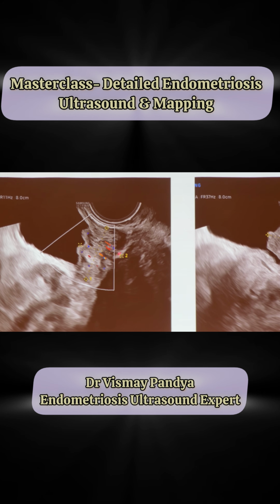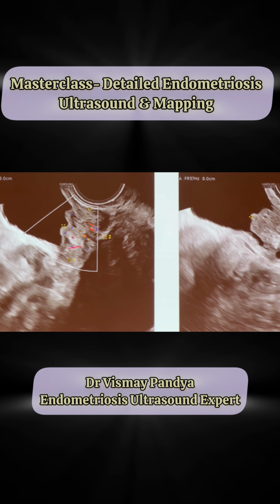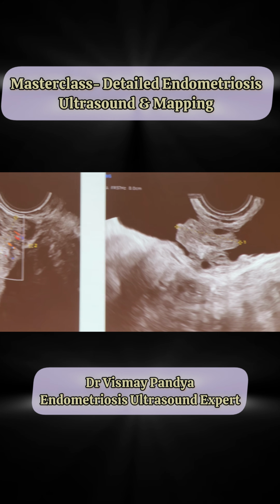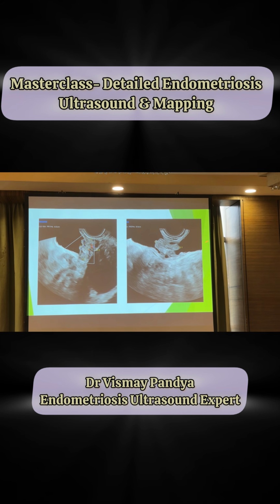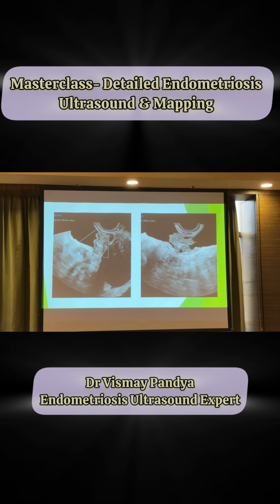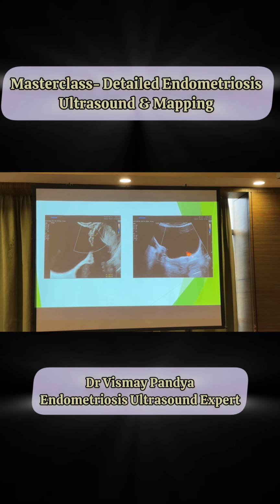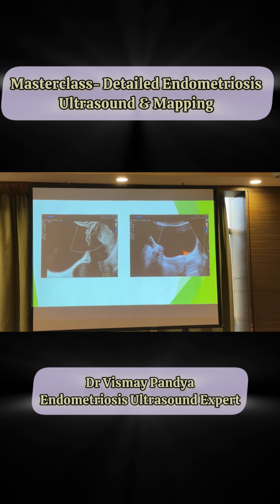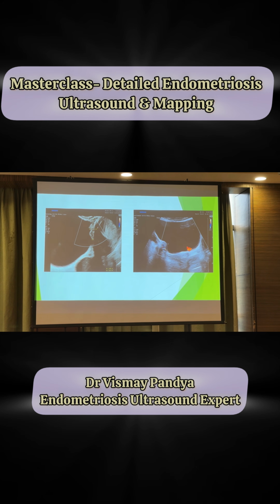So this is the bladder endometriosis. You can see this was the trigonal endometriosis. The guidelines suggest that the bladder should be looked at last in your examination, because when you have been examining for 15-20 minutes, the bladder will fill up, and that is the best time to diagnose any kind of bladder endometriosis. You can see this ureteric jet coming, and this is the nodule. If both are seen in the same plane, you can very well diagnose it as trigonal endometriosis.